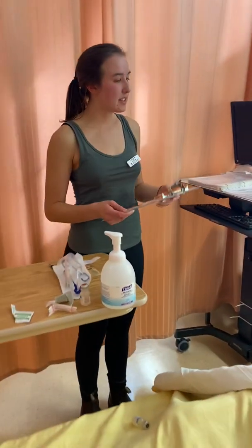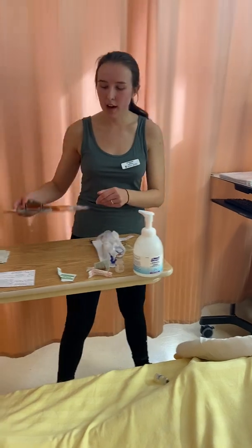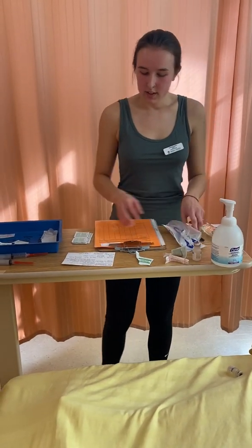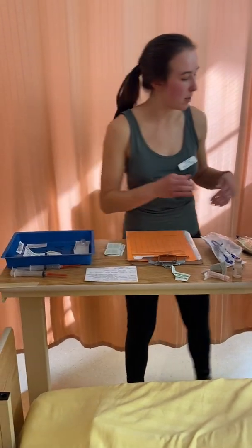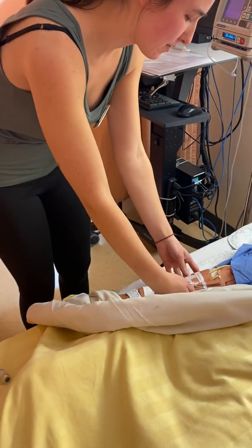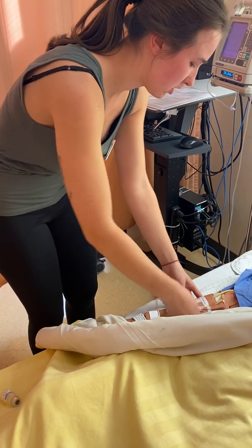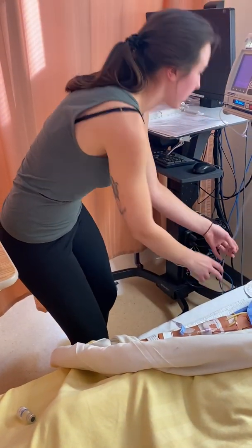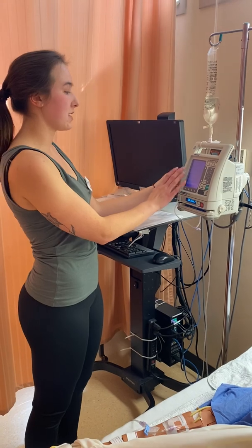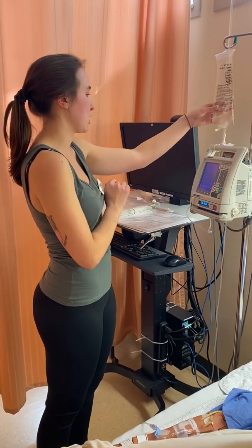Can I get you to state your name? Thank you. And your date of birth? Thank you. And do you have any allergies, Fiona? Morphine — okay. Now I'm also going to examine my patient's IV site, looking for any signs of infection, irritation, or phlebitis, and to see if it has gone interstitial. The IV looks okay. I'm going to follow the lines up, ensuring all clamps are open, that the primary is instilling at the correct rate, and that the correct primary is hanging and is not expired.